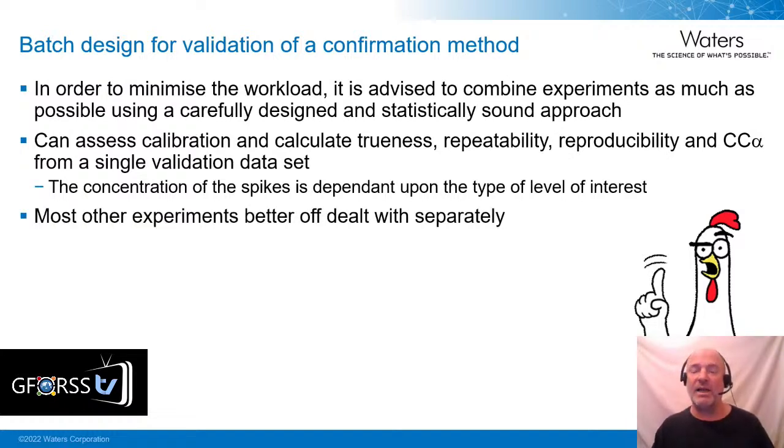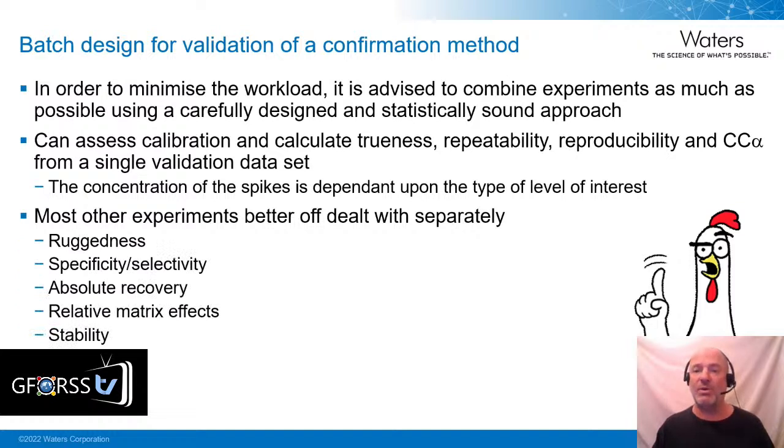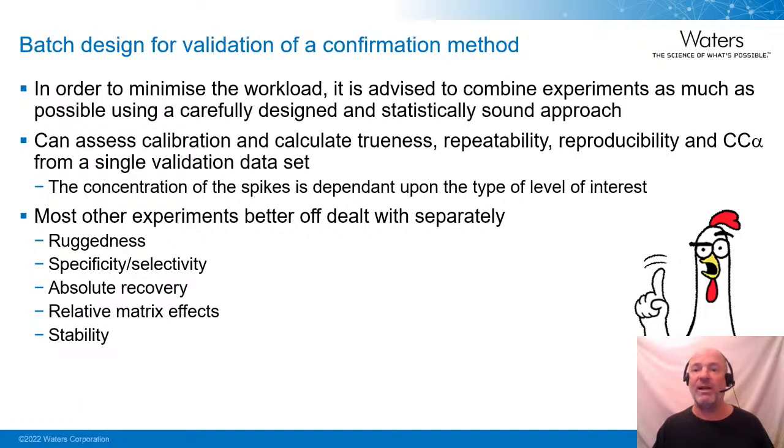In my opinion, initially, especially when you're starting out, most other experiments are best dealt with separately. So I'm talking about ruggedness, specificity, absolute recovery, relative matrix effects, and stability. And just for convenience sake, we're going to take those first.